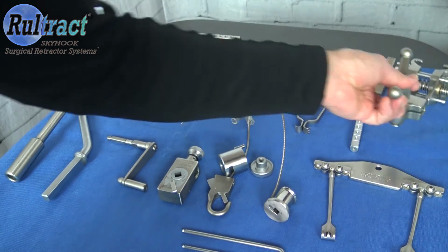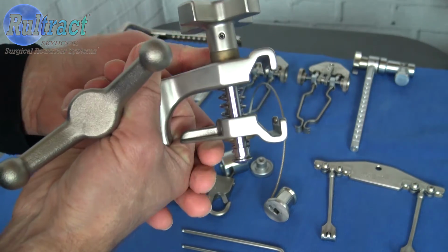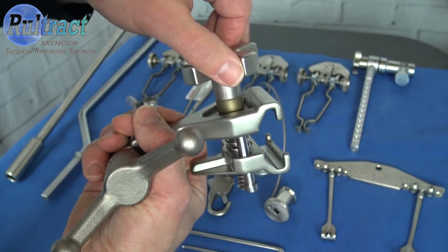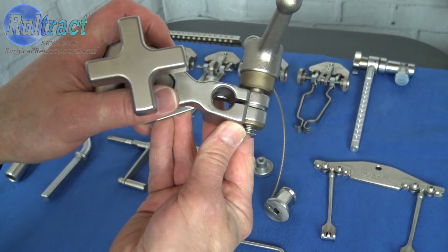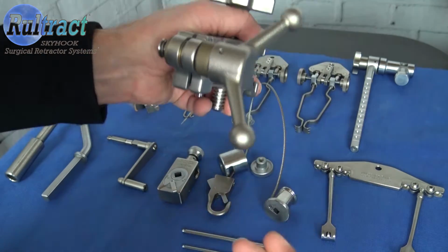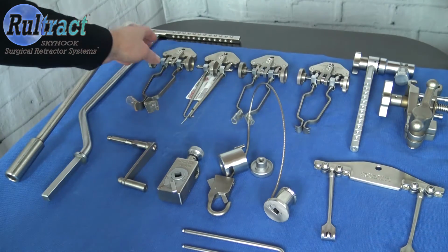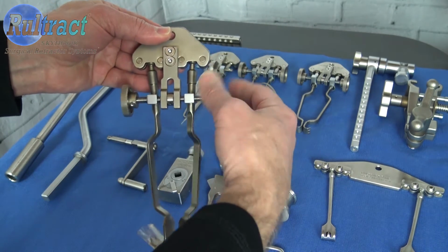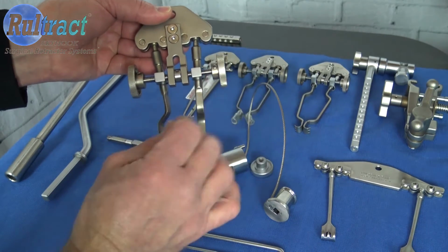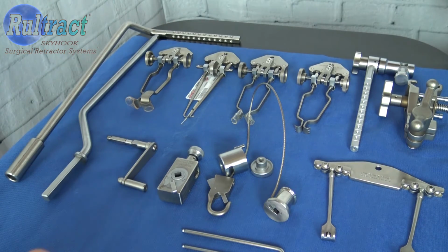Next, on your clamp, we're going to want to make sure that these clamp jaws are not closed all the way or opened all the way. So just have them somewhere right in the middle and allow the knob to have some play in it for the same reason. We don't want the heat to seize this knob into position. So with this handle, make sure that it's not opened or closed all the way, just somewhere in the middle. Each one of your retractor attachments, you're going to want to do the same thing. Make sure that these rakes are somewhere right in the middle, not all the way opened or all the way closed. And you'll want to do that for each one of the 4. Now the equipment is ready to be put through the cleaning process.